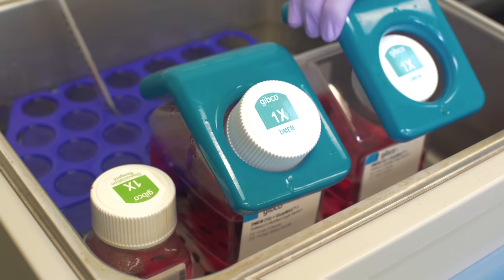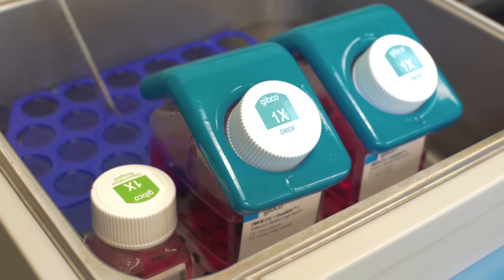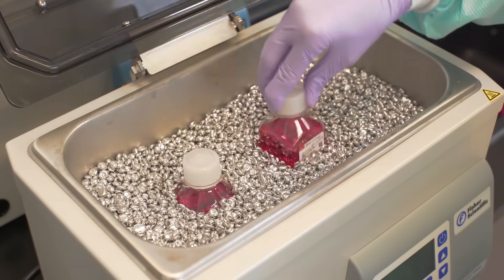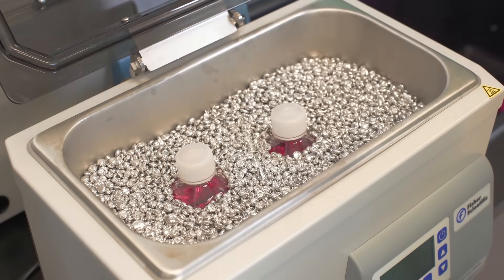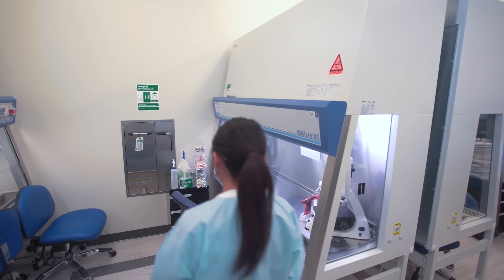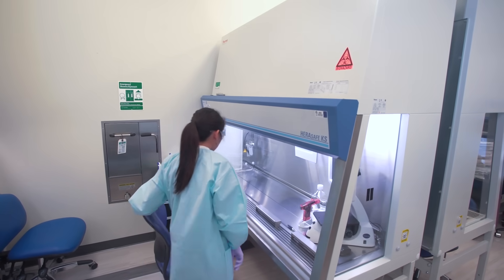If you use a water bath, make sure to keep bottles upright with necks out of the water. Specially designed bottle weights are available for use with the Gibco bottle. Alternatively, metallic bath beads can be used instead of water. Bath beads are a cleaner, greener alternative to the water bath. While waiting for reagents to warm, prepare the materials you'll need to use.